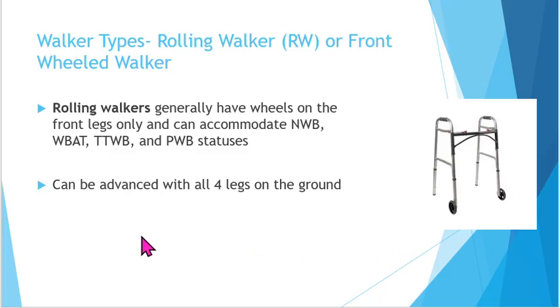It can also be advanced with all 4 legs on the ground, which to me gives it a little bit of an advantage over a standard walker that requires somebody to pick up the walker and move it every single time they take a step, which can be kind of laborious and, I think, increase the risk of them tripping over something.